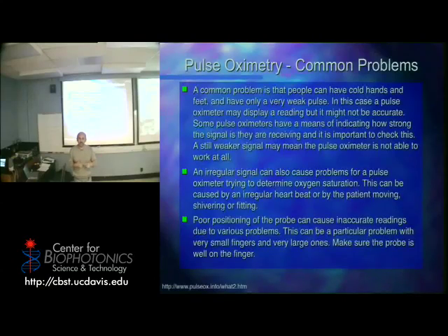We said cold hands. What is another possibility? You've lost a lot of blood. Any other possibilities? If your subject is purposely holding the breath just to see if they can make it go down. It's actually pretty hard to affect it, though. Believe it or not, I know many of you guys have tried. It's really hard to do that. Any other thing that might affect? What other reasons might have little blood in the path of the light?